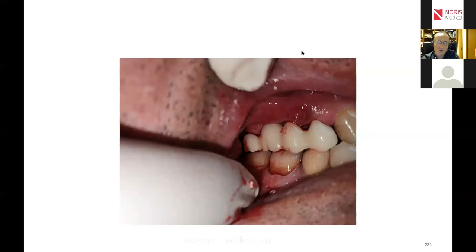I would say that 40, 50 newtons are not a problem, but you have to be very, very careful that you always put the implant in. With a new key and with a new type of implants, you can actually use an unlimited torque because the neck is actually apart from the implant.